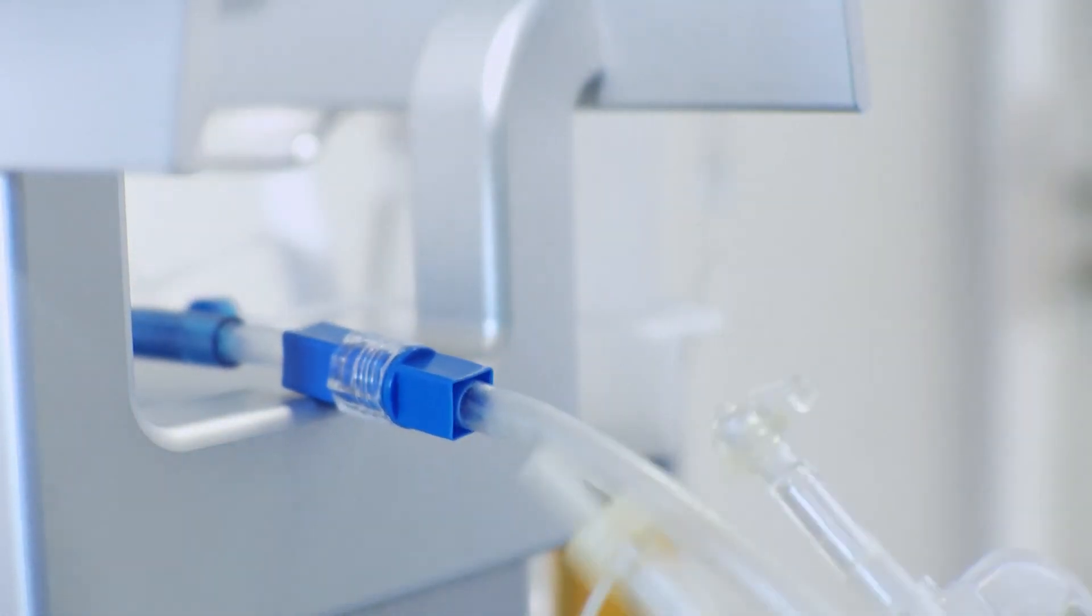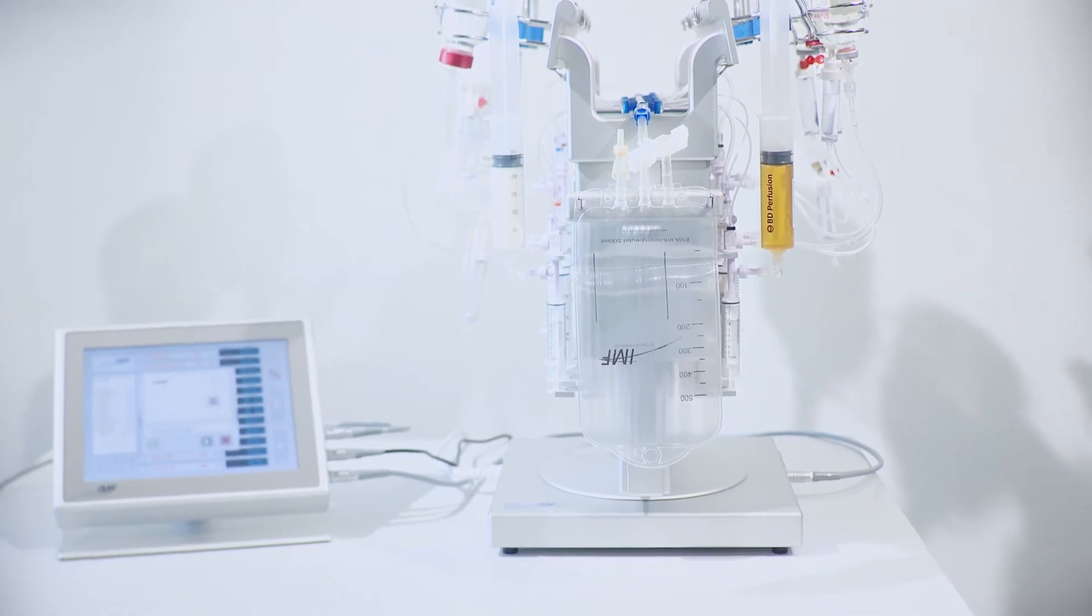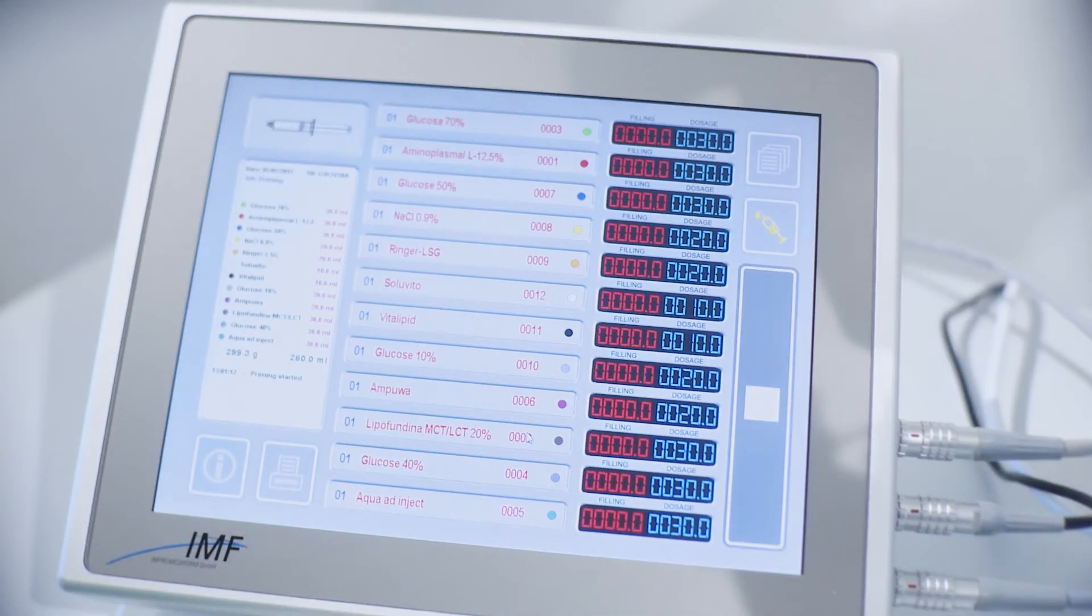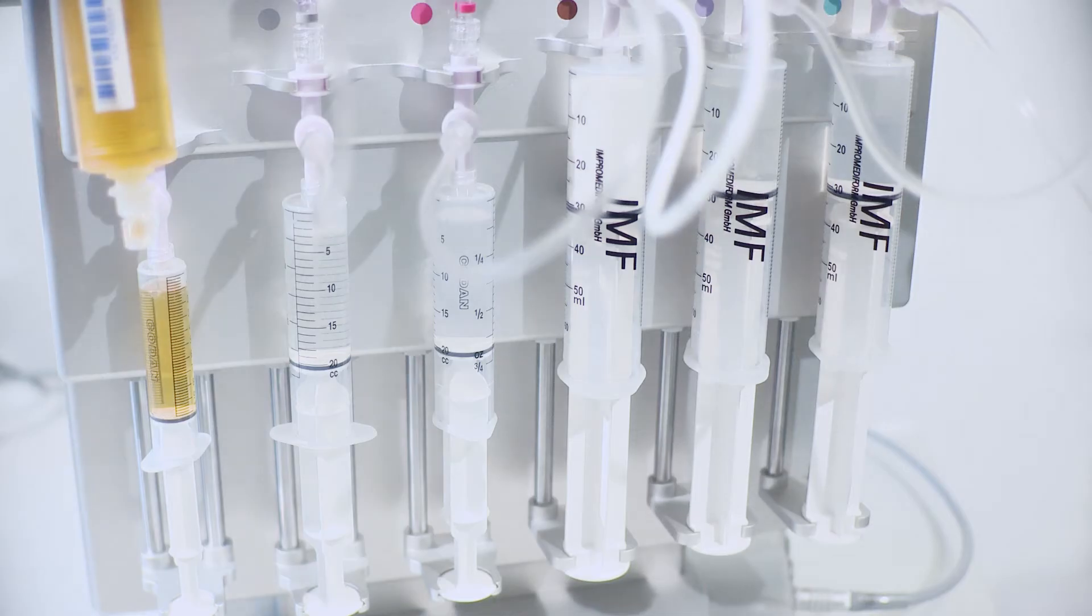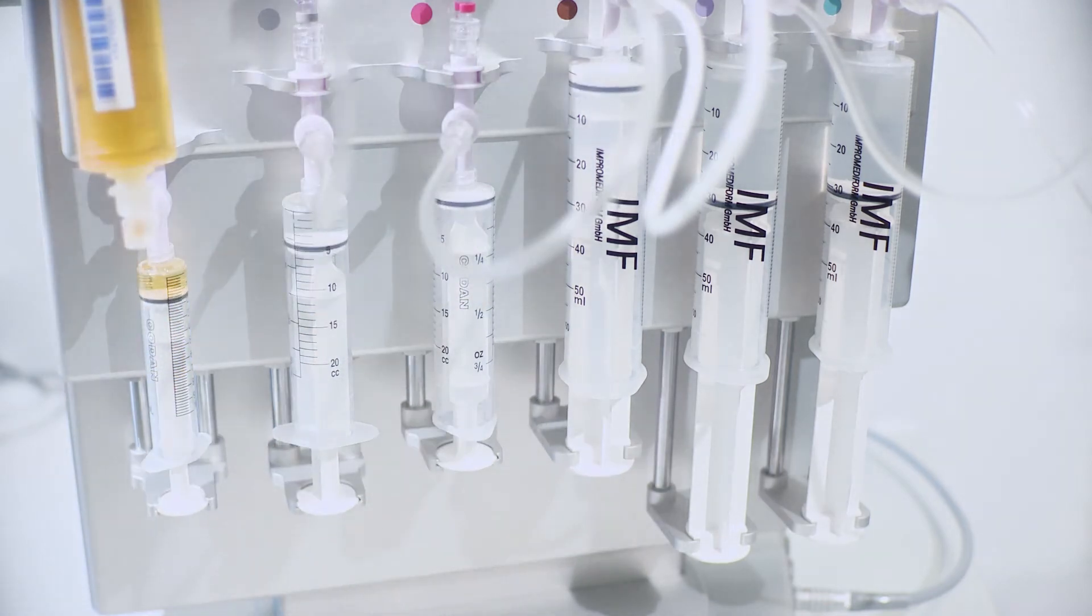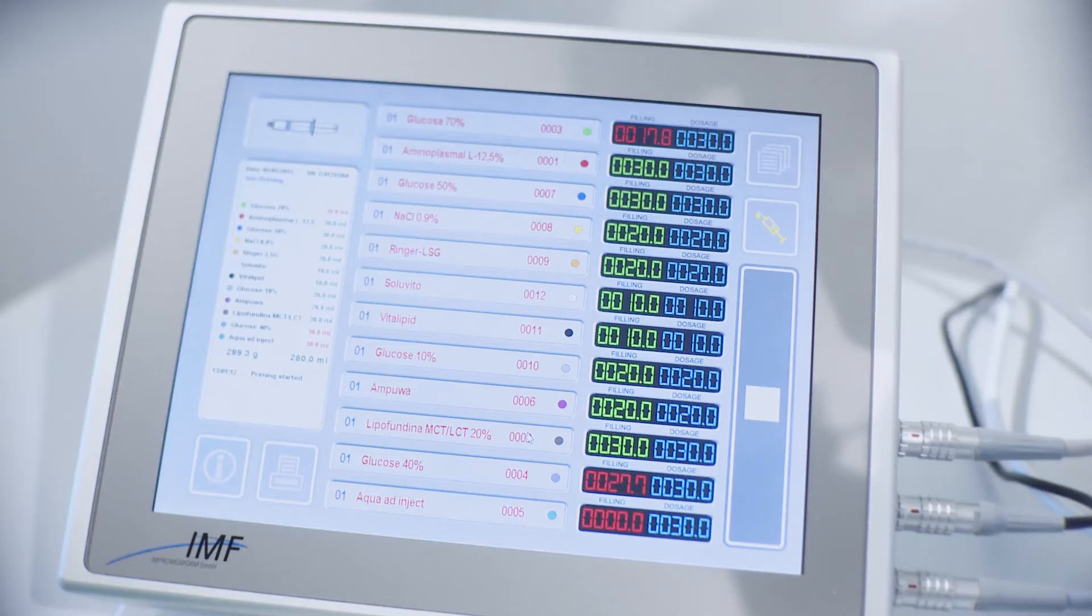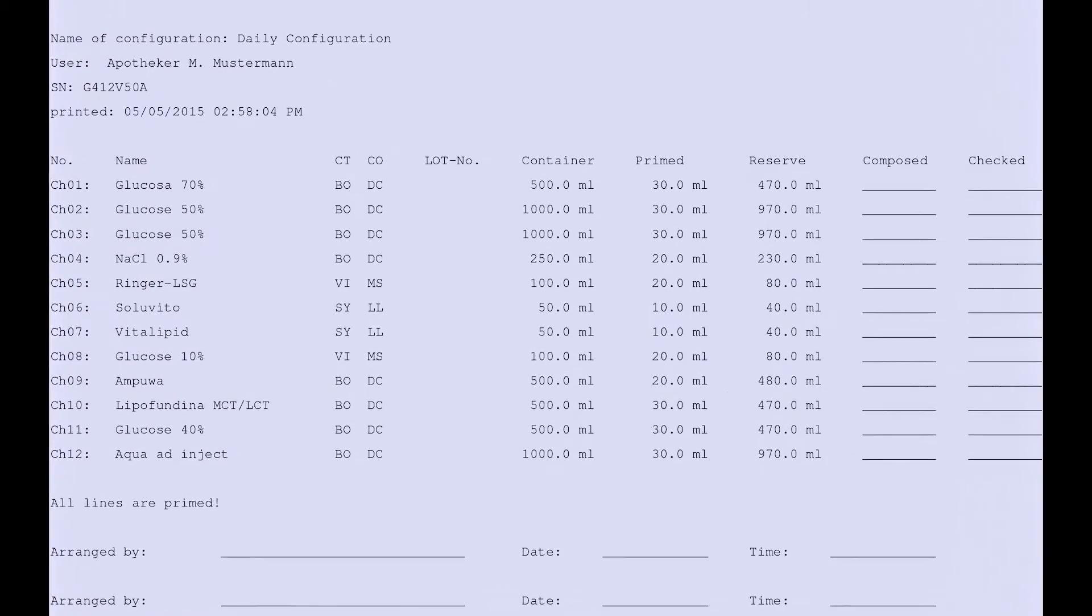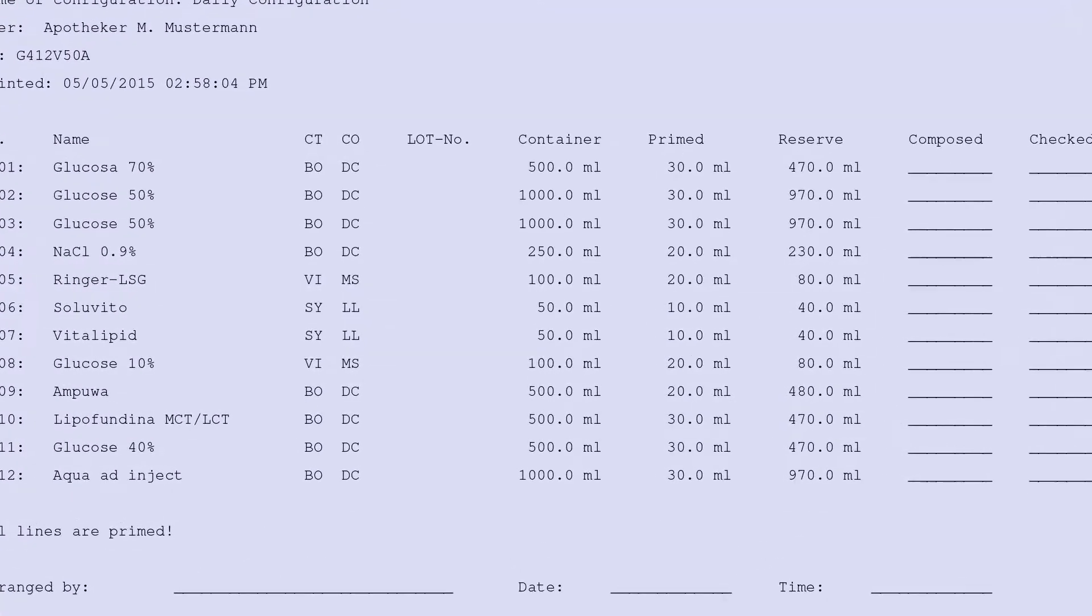The IMF rotatable nut will ensure the connection between the central line and the bag is done appropriately, avoiding unnecessary twists of the tubing. The Medimix compounder will complete the process, ensuring that all lines are filled and only the universal ingredient is present in the central line once the procedure is completed. When completed, a setup report can be printed in electronic and paper format.